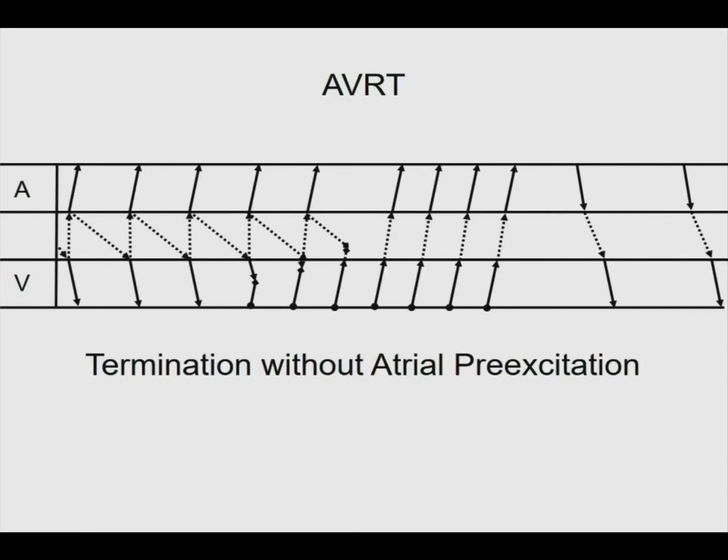If you start pacing and you terminate it, you might think, oh, I can't look at the VAV response, what a waste of time, let's reinitiate it. Go back and look at what happened, and often you'll see that you terminated it without ever getting to the atrium. If you terminate the tachycardia without ever getting to the atrium, then it can't be an atrial tachycardia, right? In fact, when you're struggling, sometimes pacing very quickly for just 2 or 3 beats and terminating the tachycardia and going back and showing you never got up into the atrium is a good maneuver too to rule out atrial tach.